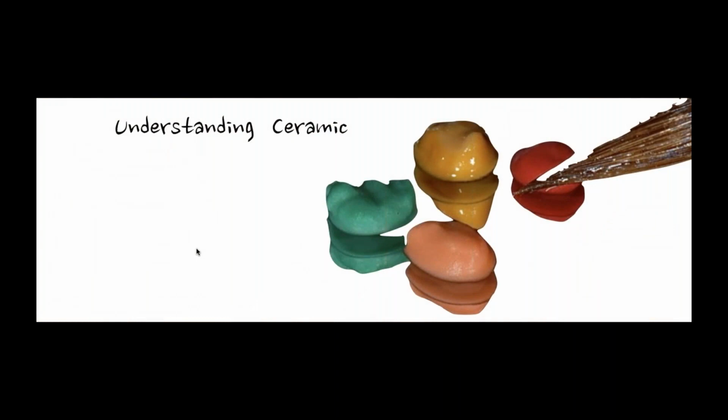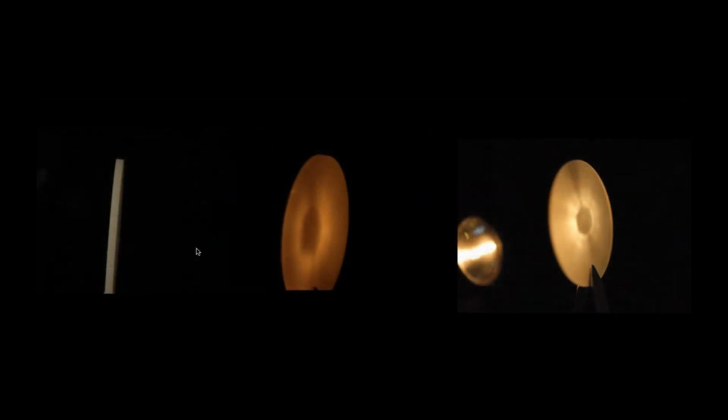So what I want you to do is really understand that when we talk about the materials at 1 millimeter thick of dentin that we have, the question that I've asked everybody a billion times is, what's the opacity of your dentin at 1 millimeter thick? And most people don't know that. I'm sure some of you have studied with me before, have some numbers in your head now. And I think that's important, because if I take 1 millimeter of dentin and I actually shine light on it, look at how much light actually goes through the dentin.